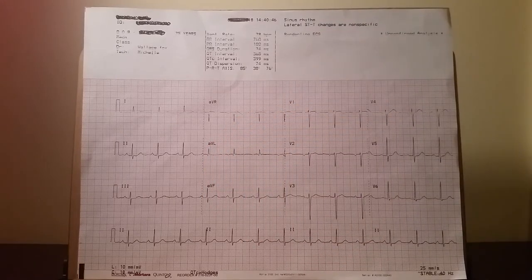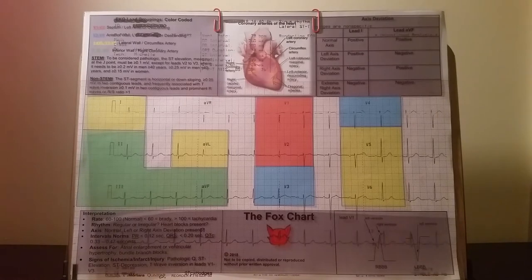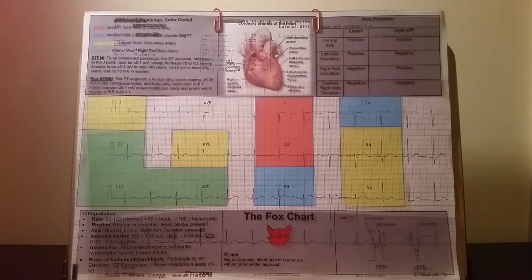Now, let's apply the FOX chart. Immediately, the user can quickly identify EKG groupings using the color-coded sections in the middle of the chart.